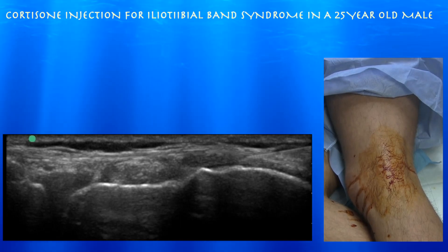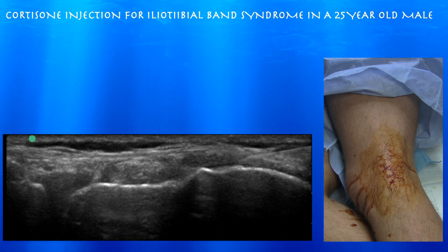25-year-old male with refractory iliotibial band syndrome, primarily with biking. He's tried physical therapy and stretching and it hasn't really helped him a lot. So we're going to go ahead and do an ultrasound-guided cortisone injection — about a half a cc of methylprednisolone with one cc of normal saline, a little bit lower dose of cortisone.